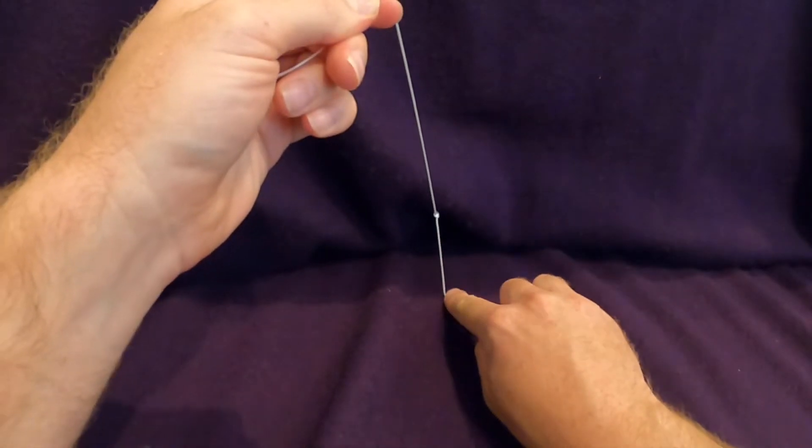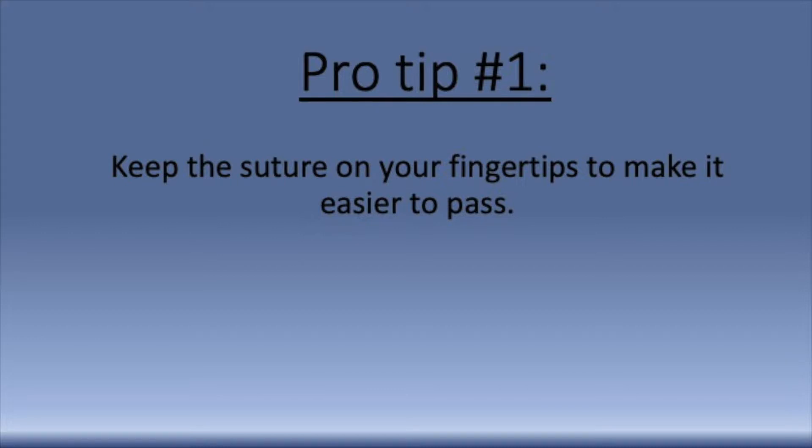The second throw is performed by using the index finger to wrap the suture and bring it through the loop. Keeping the suture on the fingertips makes it much easier to pass through the loops.